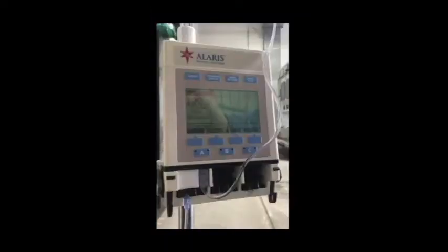When unplugging the IV pump, you simply push in slightly on the cord, pull the chamber, that'll slide back, and then you can pull it out together, and it should easily come off of the charging cable. A couple other things to remember: typically it's a red case or blue case. The case should be on the pump at all times. The charging cord, be very careful with them. They're expensive and they break easy. So be gentle with your equipment.